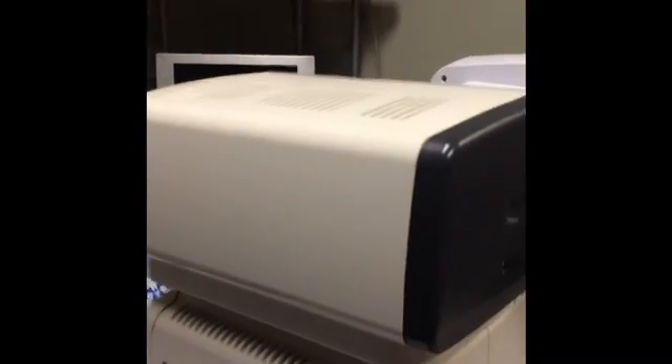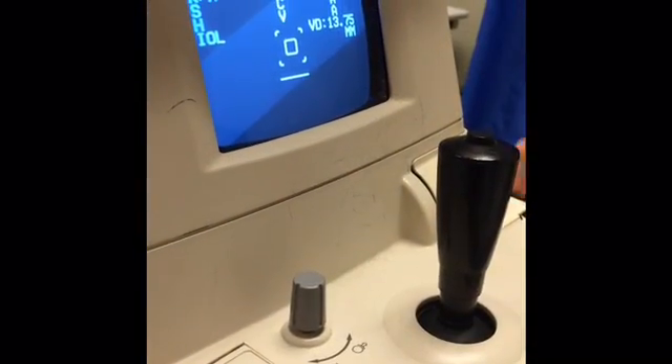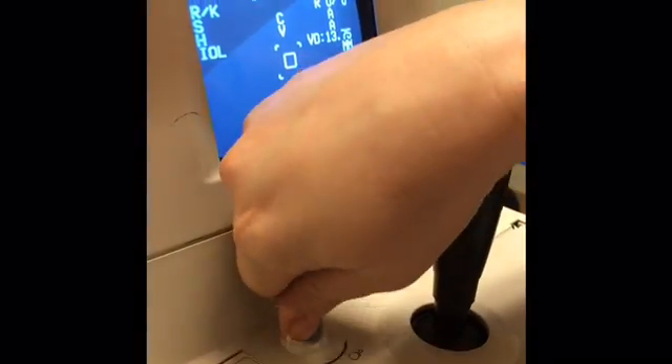This is an automated refractometer, or an AR. To begin, you must turn it on. After turning the AR on, you need to unlock it.